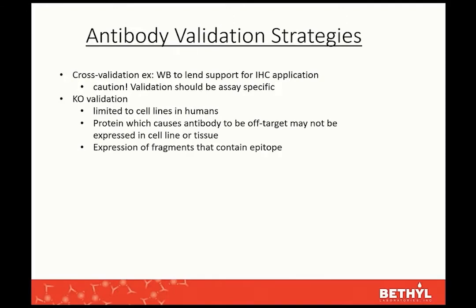So you'll have a clean experiment. So the antibody does not recognize the protein of interest in the knockout cell line. But then when you move to tissue, it may be off target.